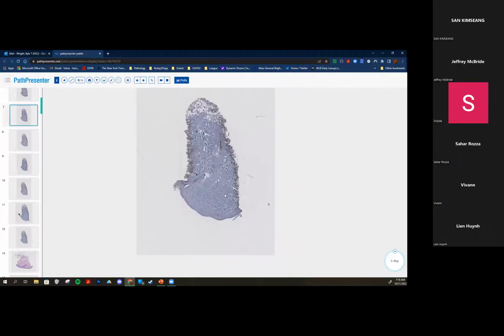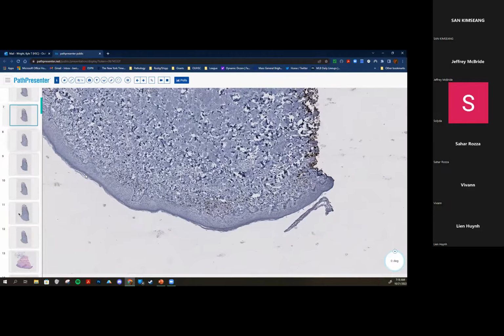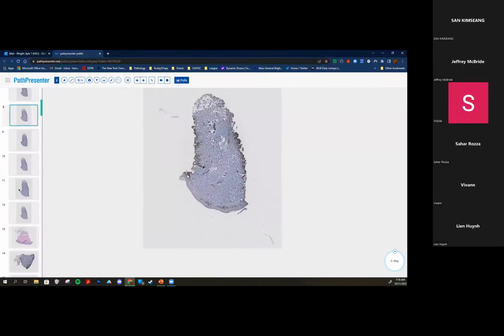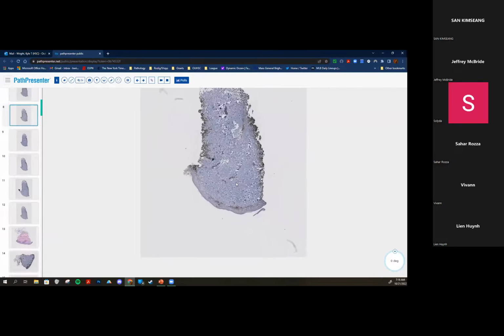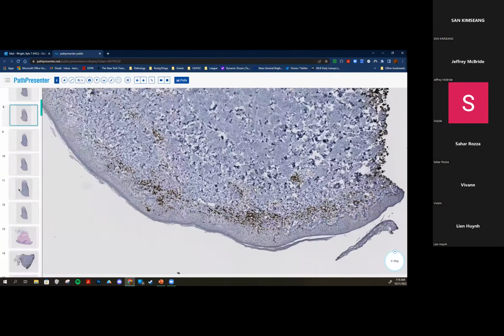And there's very rare CD8 cells. So once again, this lymphocytic infiltrate is composed predominantly of CD4 positive T cells. We now have CD2, CD5, and CD7. These are pan T cell markers, which can occasionally be lost during heme neoplasms, especially T cell lymphomas.